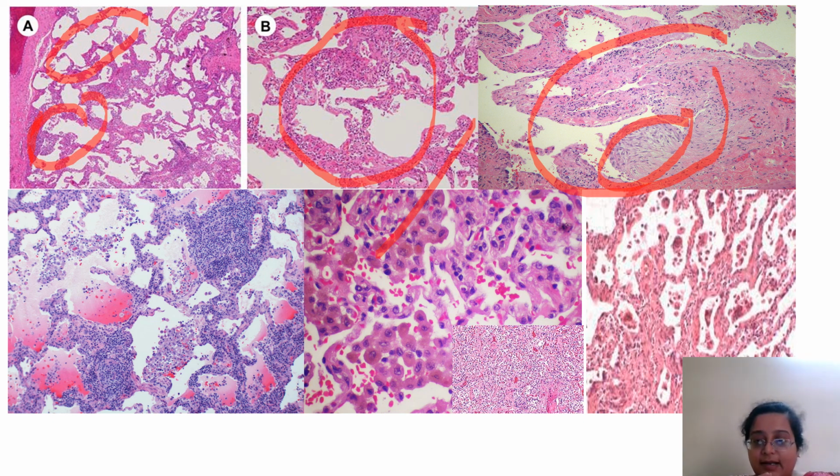It is not as easy as I'm sounding right now. But repeated learning and repeated reading can help. If I were here, I see okay, this is normal, this is not. So this is more of patchy involvement. This could be UIP. This is a high power, so I won't comment. This can be going into a later stage where there's fibrosis developing. So this is how, and then we correlate with the X-ray findings.